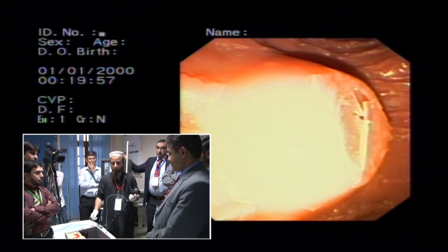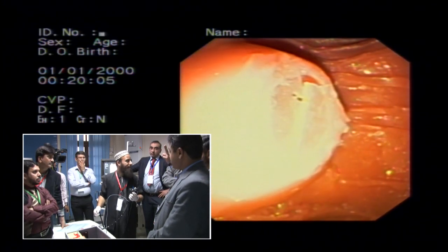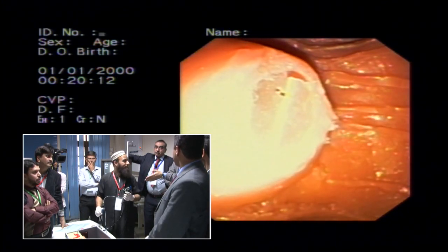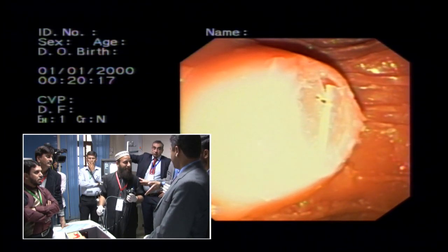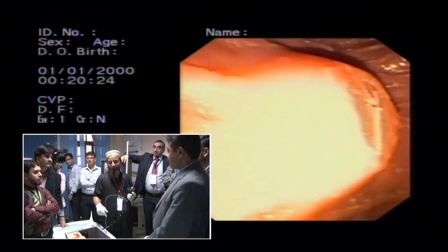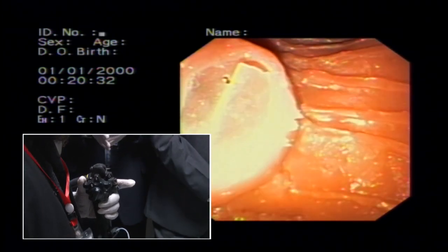You are already doing that, you are doing something that's moving your ampulla. हाँ ये very important movement. No, दोनों different है। Small wheel is different, this is totally different, and this is very important. You have to understand this movement, जिसको आप लिफ्ट ही नहीं करते केस करते हुए, कि देखो what is this doing. I mean all he is doing is: look at me, turn towards me, Dr. Abdullah, ampulla is gone there. Turn towards the other gentleman there, ampulla is there. You just ignore this beautiful movement. And to me, this is what we teach you there.